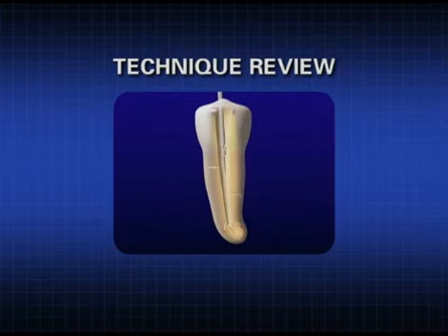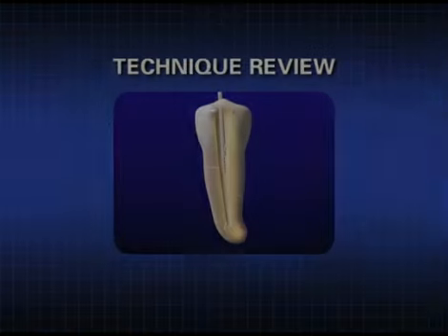Remember, to break an occasional instrument is human. To retrieve one can be divine. During this tape, we have discussed the successful strategies and techniques to remove post and broken instruments. In all human endeavors, words are words, explanations are explanations, promises are promises, but performance is reality. Training, practice, and technology are the stepping stones that create a winning performance.